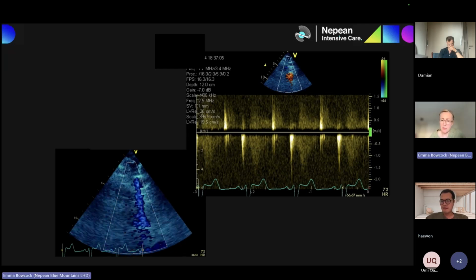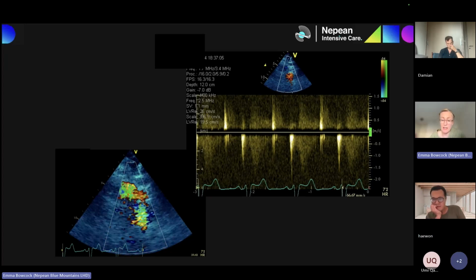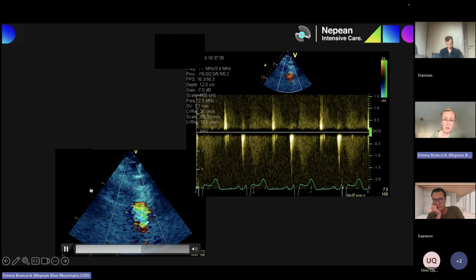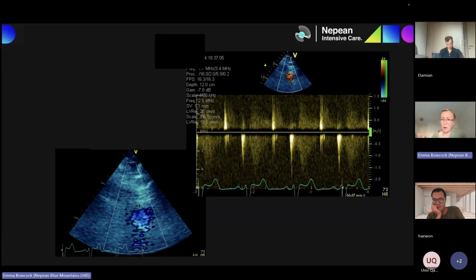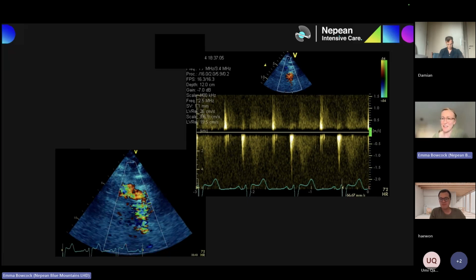So that's your usual management there, but the key thing is taking that balloon pump out, which, as you clearly said, is now contraindicated, which is beautiful. I don't really know how to interpret the descending aortic flow when you've got a balloon pump in there. I think that's where these sharp spikes are coming from. You can see some holodiastolic flow reversal, and all that turbulent, awful diastolic flow coming back. But you've got the balloon pump in there as well, so it just clouds it, doesn't it?